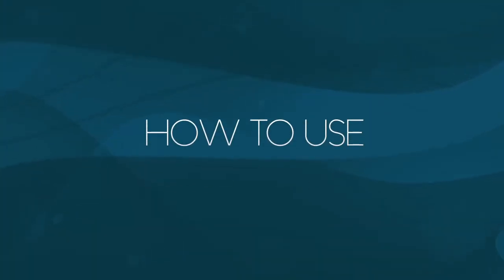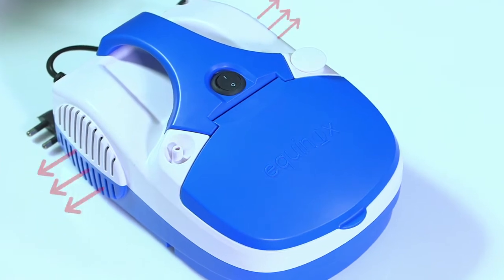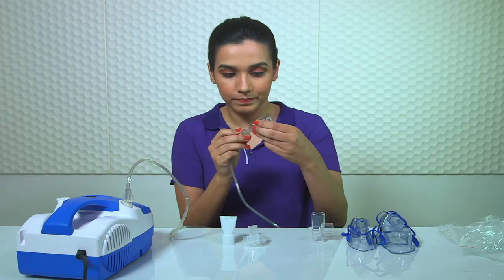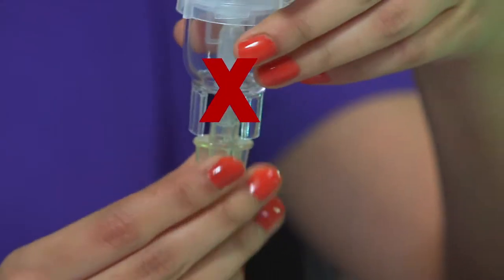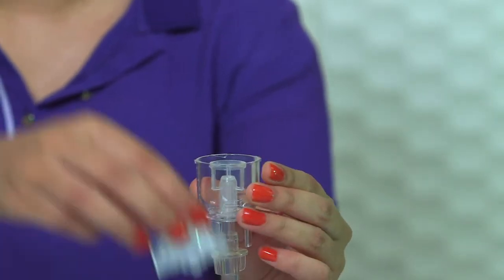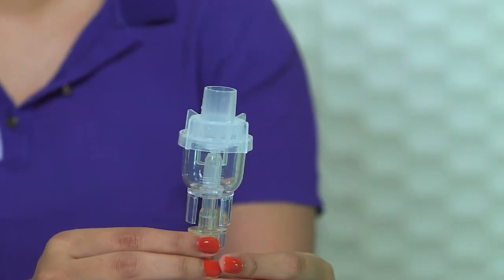How to use? Keep the nebulizer so the air openings remain open. Connect one end of the air tube with the air outlet of the nebulizer and the other end with the medicine chamber. Please do not connect it too tight at either end. Now, put the prescribed liquid medicine in the prescribed quantities into the medicine chamber and close the chamber correctly.